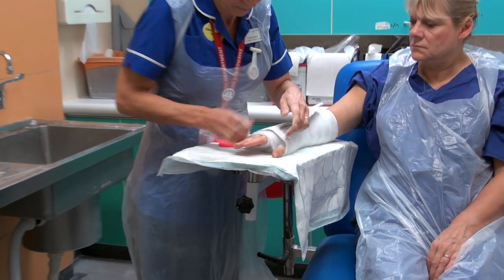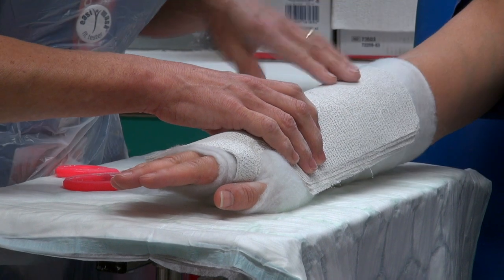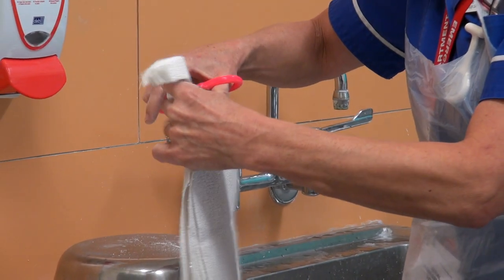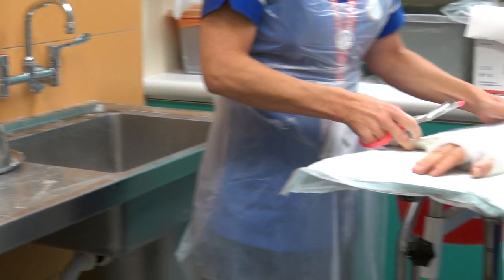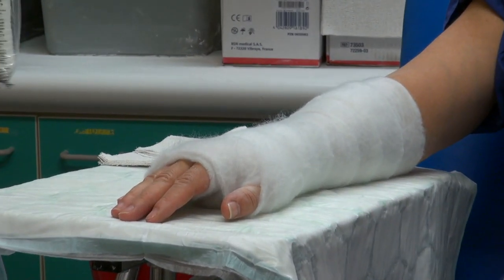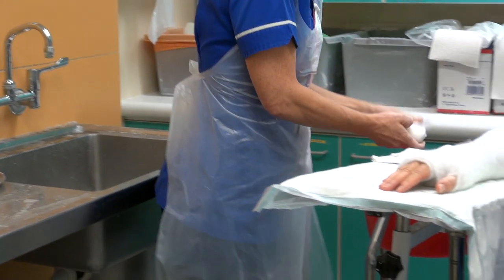I'm just going to check that it's all OK. I'm going to take a little bit off there so the plaster doesn't come over the top of the metacarpal heads. For the bandage, I'm going to put it in just to pre-soak. If you put it on dry and then get some shrinkage, it's going to become too tight for the patient — so if you pre-soak it first, that will prevent that from happening.